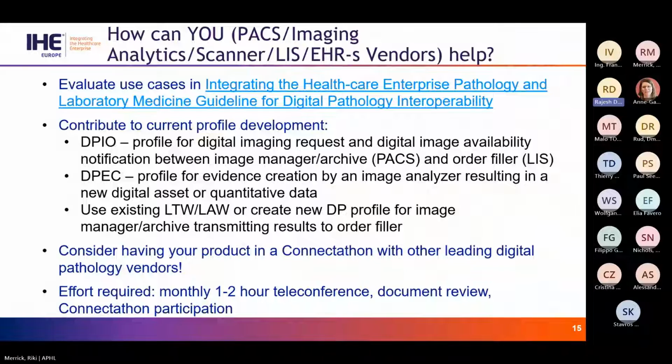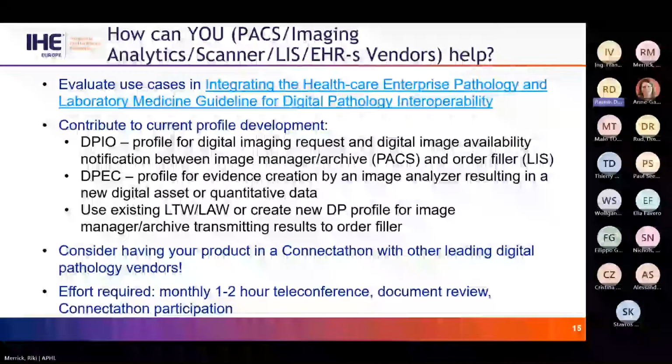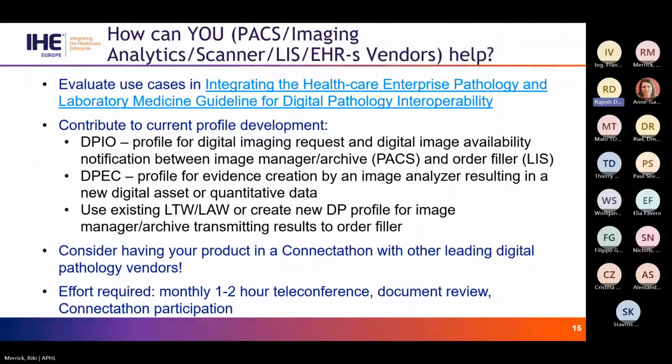We had significant input from Philips, Leica, and Roche, and input from a couple of LIS vendors in the USA and in Europe. And that was instrumental to ensure that we had a profile that was truly functional in supporting the use cases. So please consider having your product in a connectathon with other leading digital pathology vendors. We have a monthly 1 to 2 hour teleconference where we review the documents, go over the profiles, try to make progress, and plan for connectathons. Next slide.